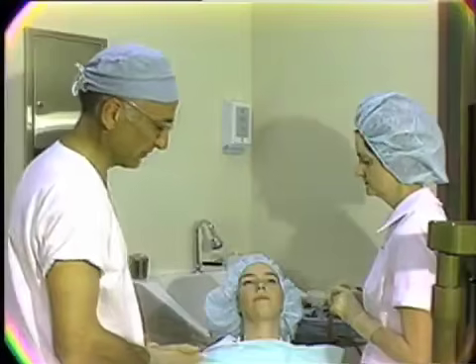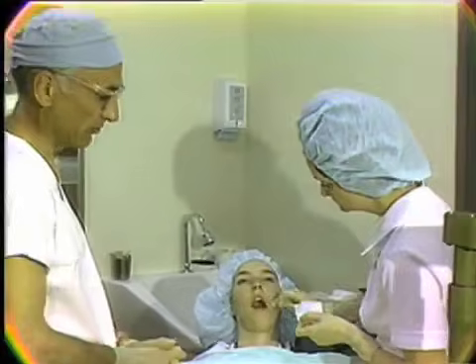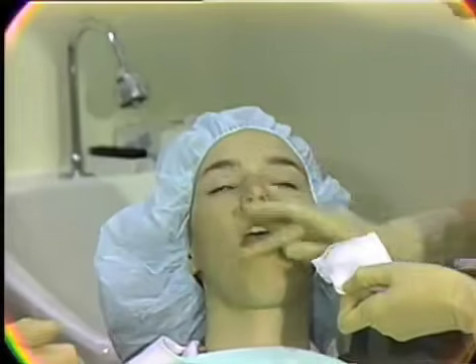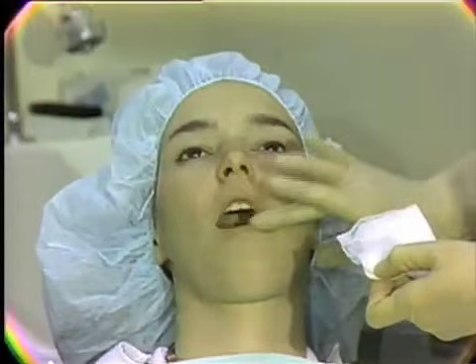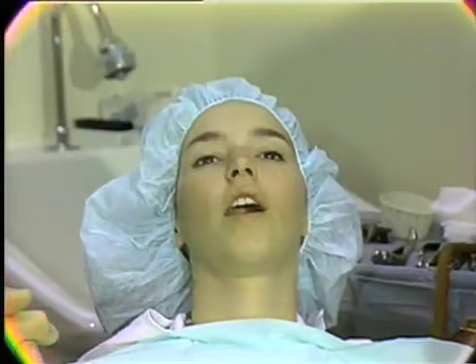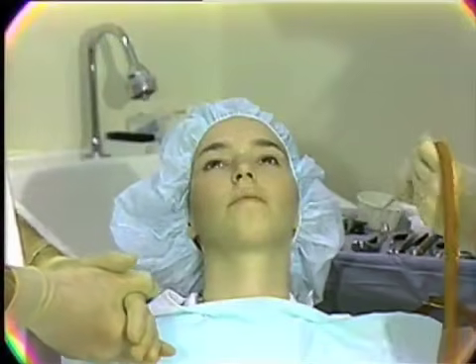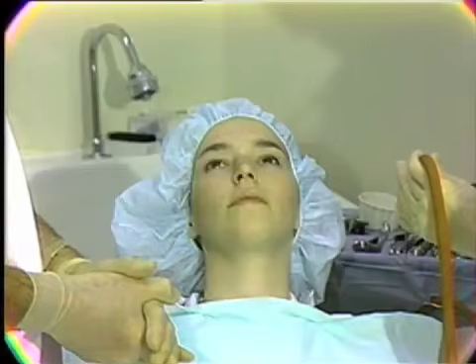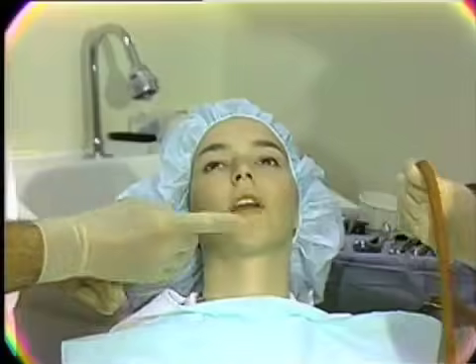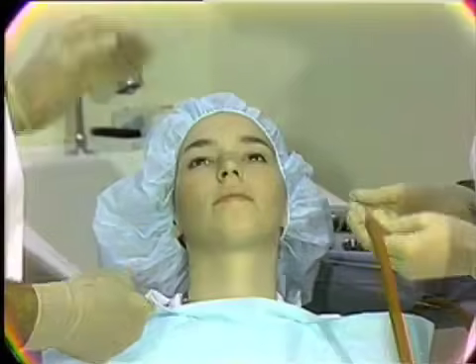Our surgical assistant, Miss Itzel, will begin the lubrication of the commissures of the mouth. In surgery, often we retract the corners of the mouth and cheek rather excessively, and unless the mouth is well lubricated, the lips may crack, and so for the patient's comfort, we begin in this manner. We will attempt to show the several positions of patient, operator, and assistant as we go into the several areas of the oral cavity for surgical procedure.